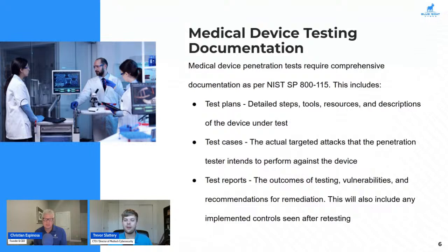Sometimes a certain control may be half implemented or implemented incorrectly. And if that's the case, it may be possible for us to work our way around it and compromise the system a little bit further, even though there's a little bit of a control in place. So we want to verify that's not the case and help the developers understand best practices for fixing it right the first time around. But of course, if there is something that goes wrong, we want to make sure that it's fixed right after the fact and we are not able to exploit it before we create that final report.